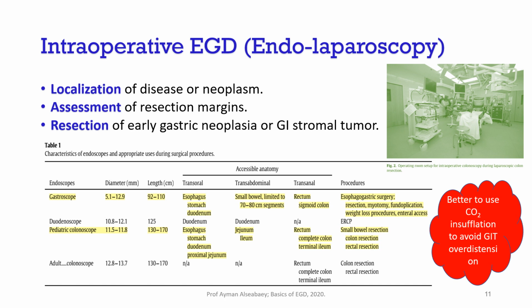During the resection for tumor, sometimes the surgeon will ask you to do endoscopy to assess the resection margin, and also in some early gastric neoplasia, the surgeon may call you to help him. Okay, so this is a new concept.